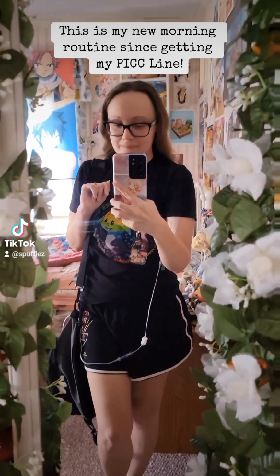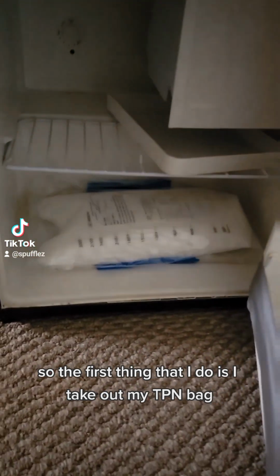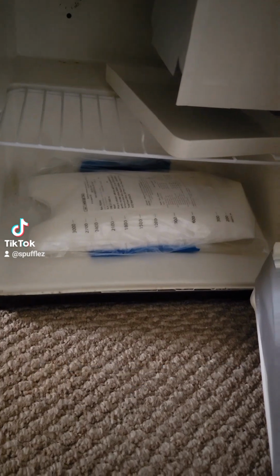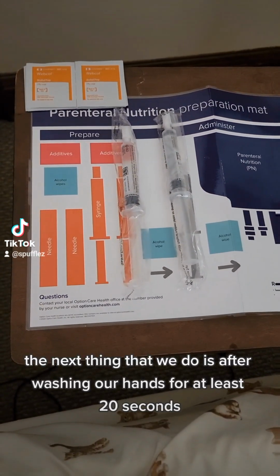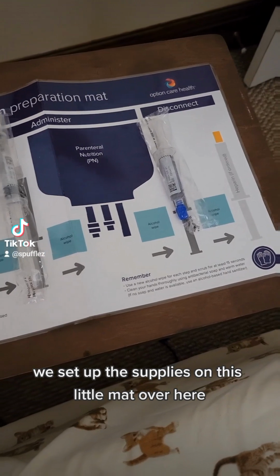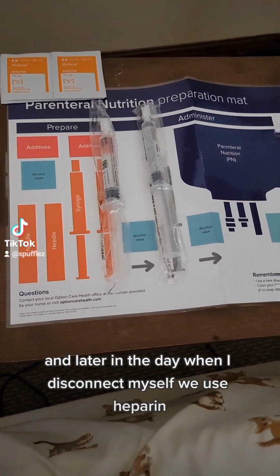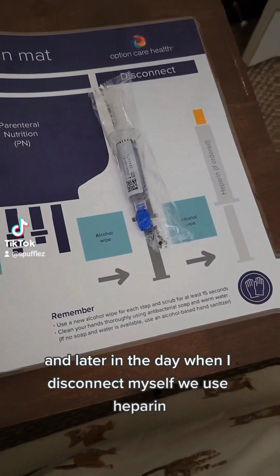So, the first thing that I do is I take out my TPN bag a few hours before we start the IV. The next thing that we do is, after washing our hands for at least 20 seconds, we set up the supplies on this little mat over here. We have some saline, and later in the day, when I disconnect myself, we use heparin.